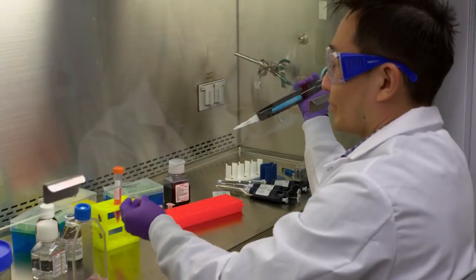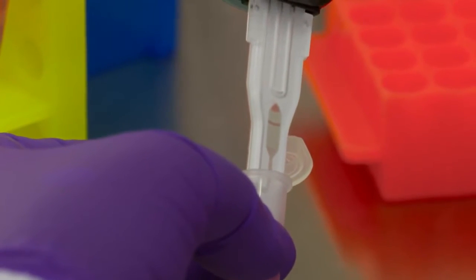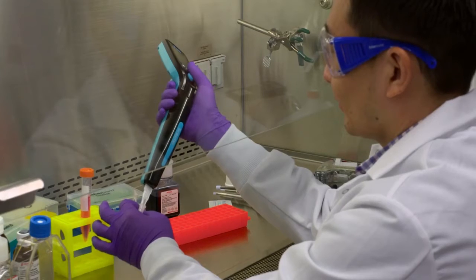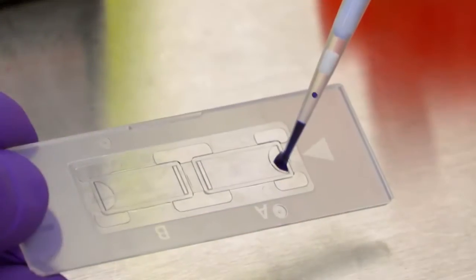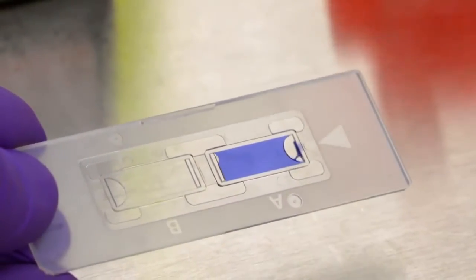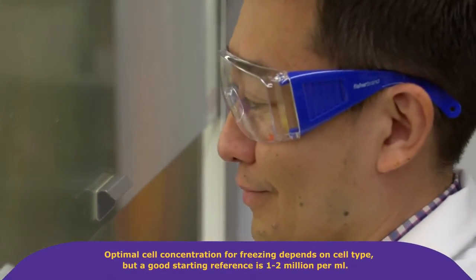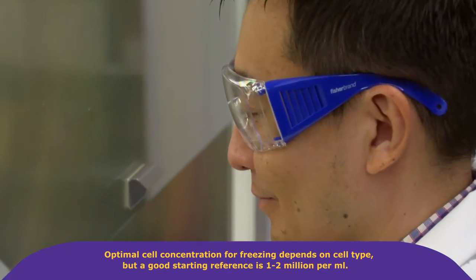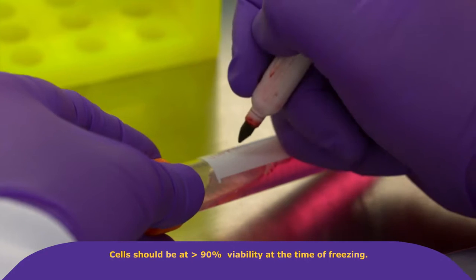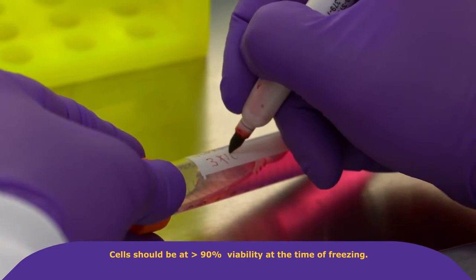Take a small aliquot for count or count plus viability assessment using a cell counter or disposable hemocytometer, respectively. Optimal cell concentration for freezing depends on cell type, but a good starting reference is about 1 to 2 million per milliliter. Cells should be at greater than 90% viability at the time of freezing.